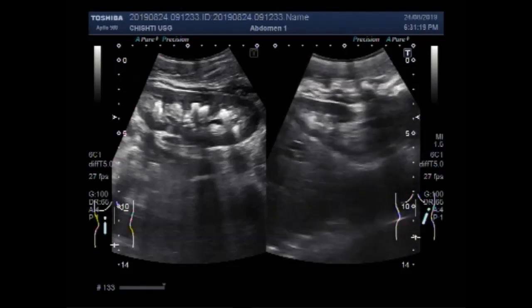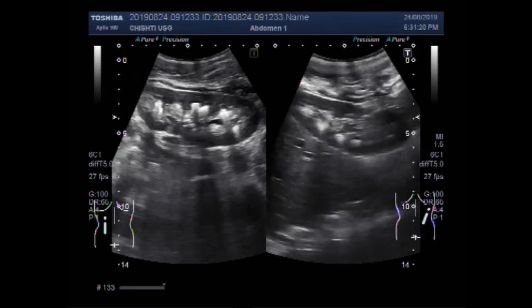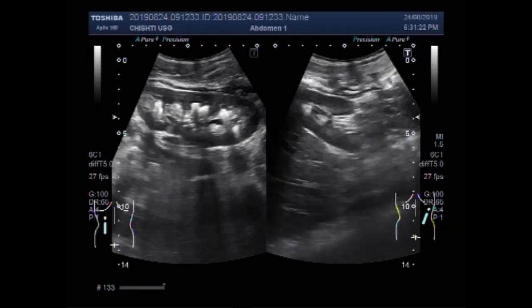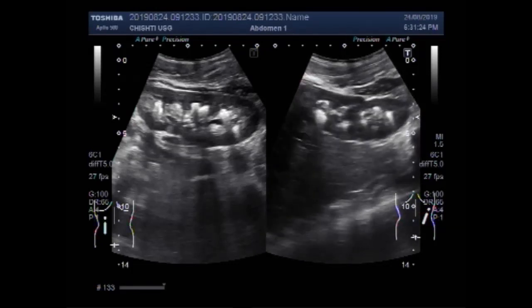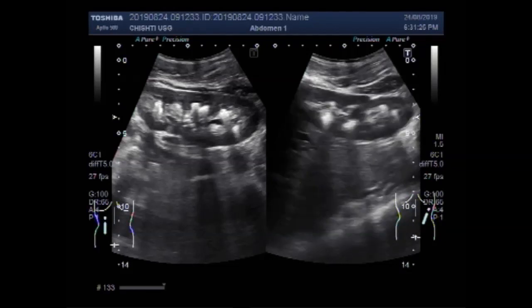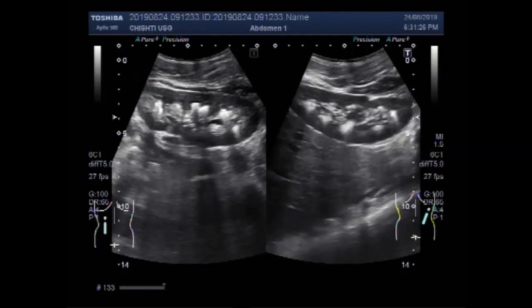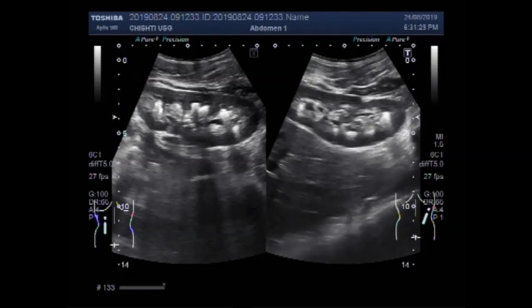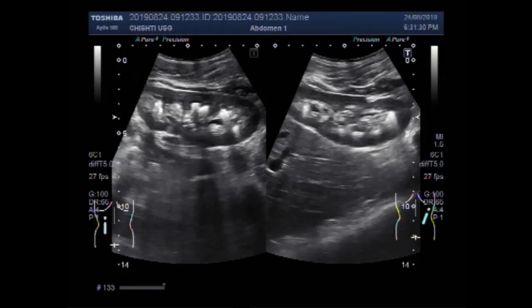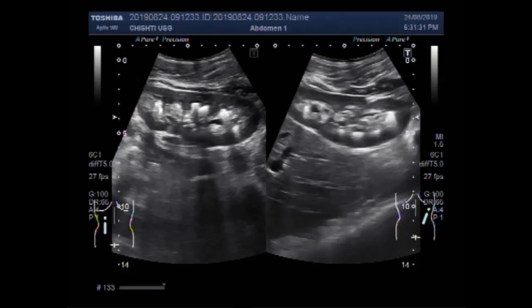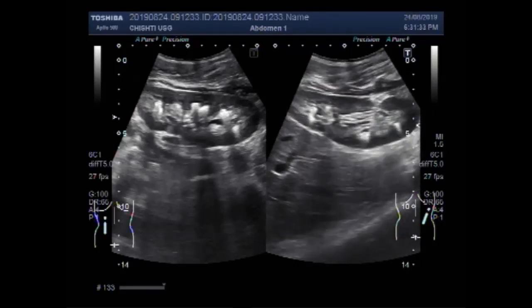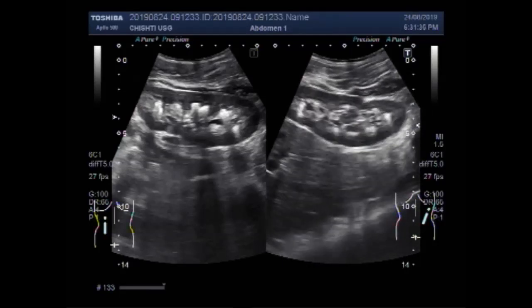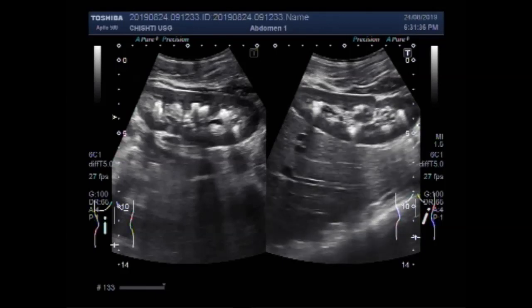Now this is the right kidney and you can see multiple stones in the renal pelvis and the middle region of the kidney.